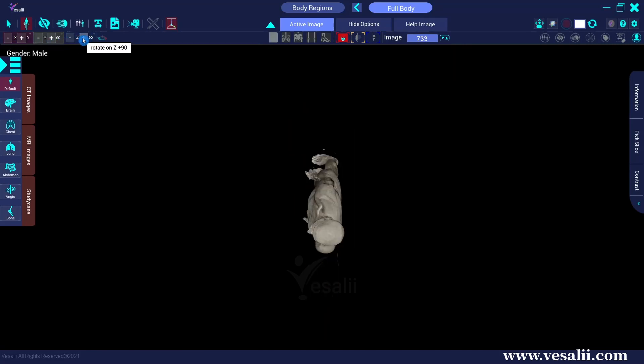We can reset or undo the rotation action by clicking on the reset body rotation button here.